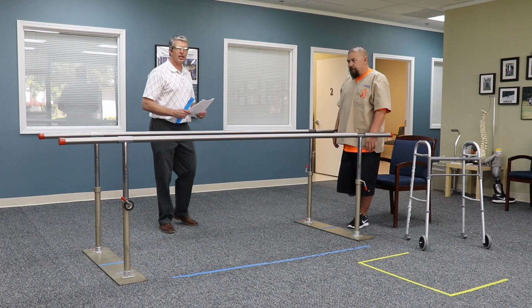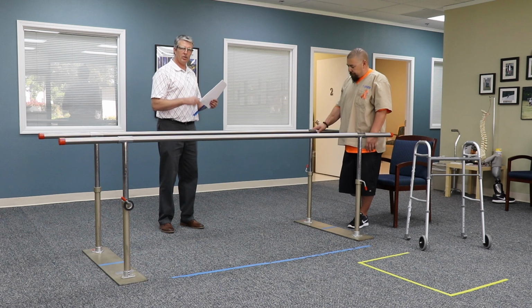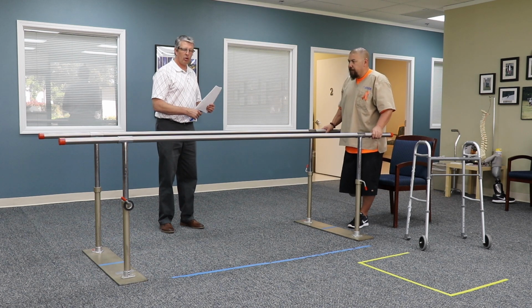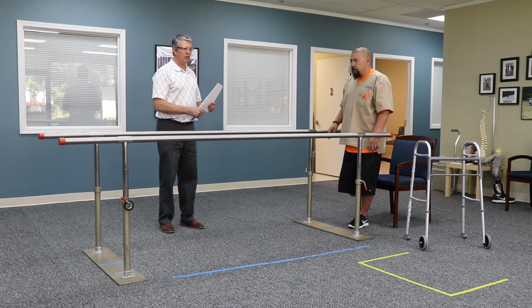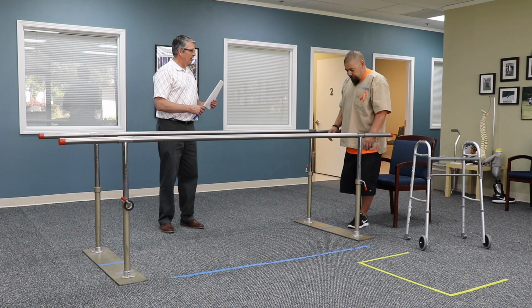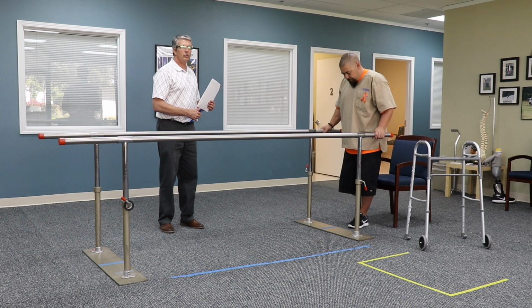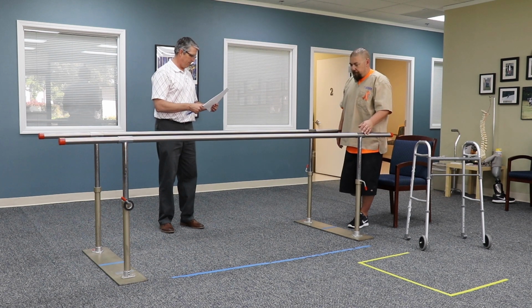Okay, as you can see, in that attempt, he was able to accomplish it. He rose from the chair, but it took him 2 attempts to do that. He had to adjust his position in the seat of the chair first. He had to use the parallel bars for leverage to get to the standing position. His immediate standing balance wasn't so good, so he had to keep touching the parallel bars to get that balance. And then you can see he's hovering over the parallel bars for that 30 seconds of standing. So he wasn't able to accomplish 30 seconds standing without an assistive device, the parallel bars.